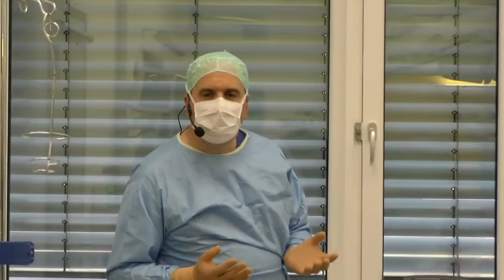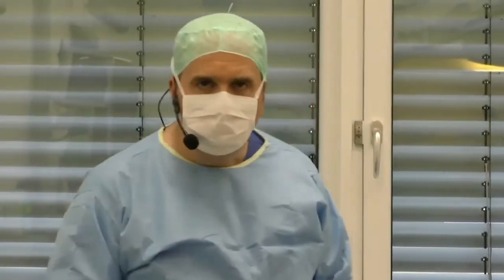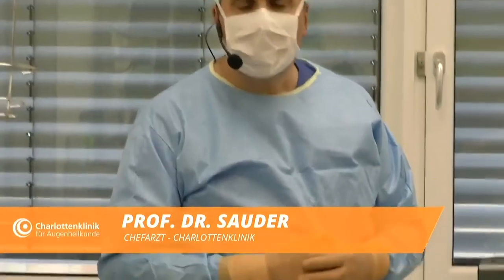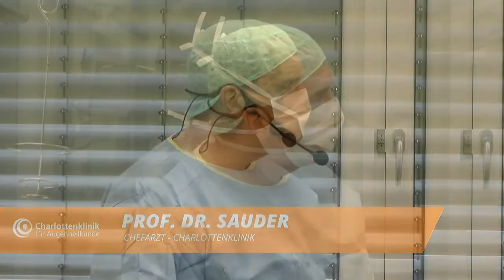I don't know if you agree, but you can damage any haptic of any IOL. And you, of course, can damage the haptic of the basic IOL or the AddOn IOL as well. But there are different kinds of damages. If you have a rupture at the basis of the haptic, you have to explant the lens. If you have a slight incarceration at the end of one haptic, and the IOL centers properly, there's normally no need to take it out again.